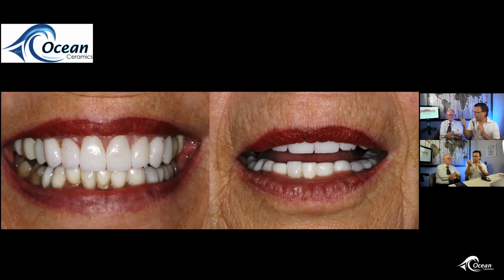They've got this system, an Element something. They've got the big, huge screen on the trolley. Well, they've got an iTero of some sort. Anyhow, I says, Heidi, scan upper, lower, centric bite, send the file in.